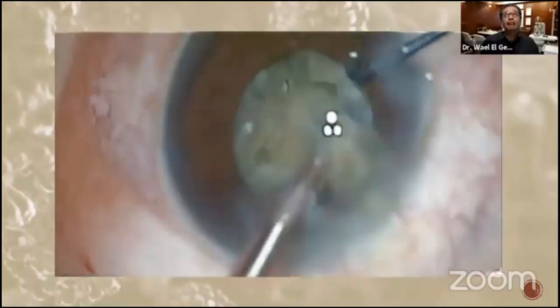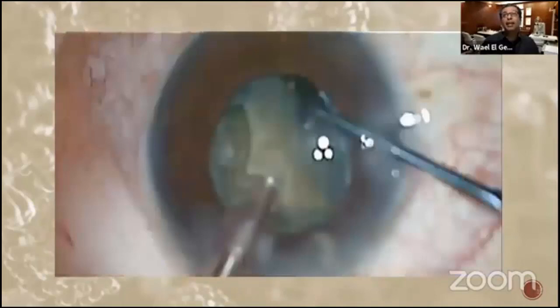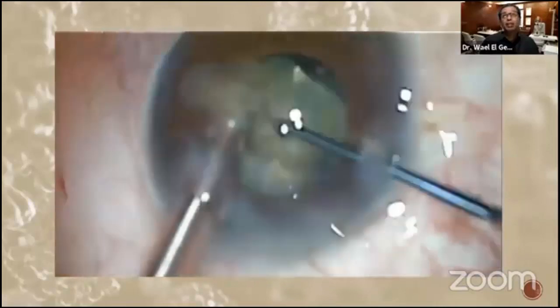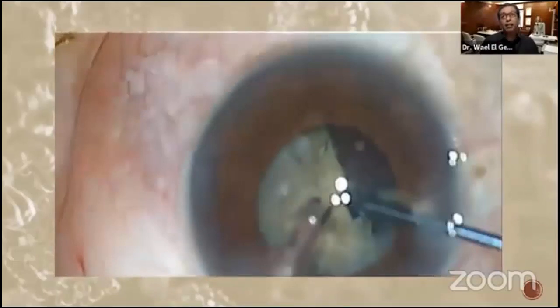As you can see, every time I hold something, I go with the chopper and try to emulsify it. I don't leave small particles flying away because these particles would hide from me later on. Every time I hold a quadrant, I will chop it and make sure that it's small quadrants. I'm using very high vacuum with efficient Phaco, just releasing Phaco with high vacuum and high flow rate to attract particles directly to me. My Phaco is definitely pulsed Phaco.